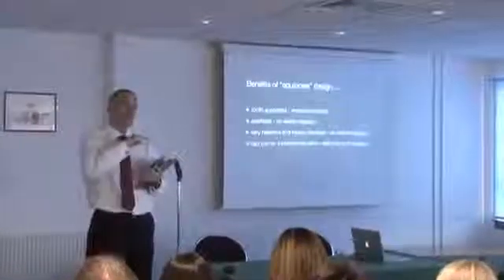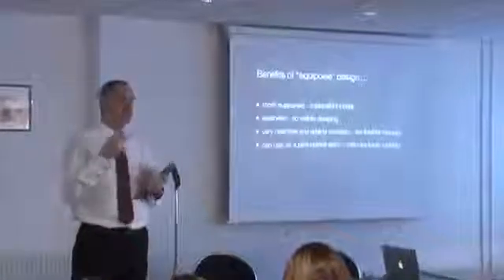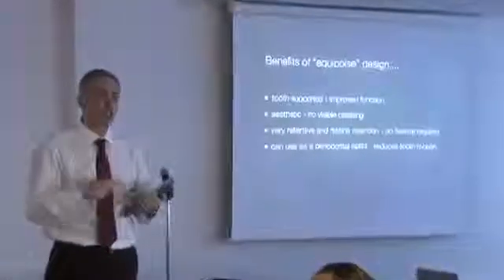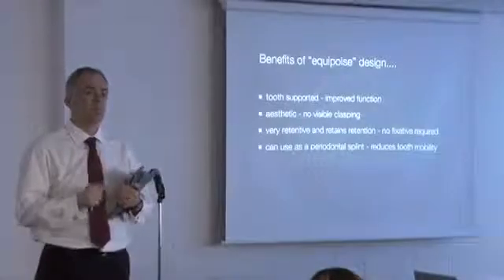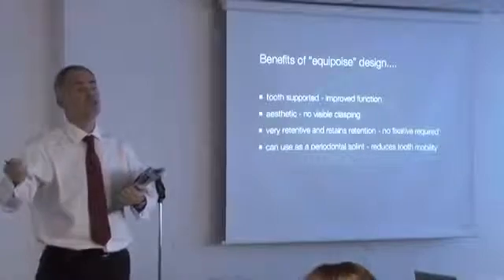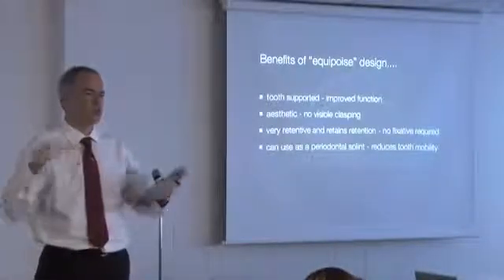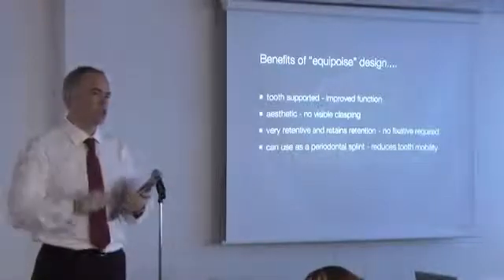This is something that I think we all avoid. We have periodontally involved patients. We would like to splint those teeth together, but we don't want to invest in the cost of doing both when we know we're going to have to do it again in a year when they lose another tooth. We can use this as a periodontal splint, and we can design it in such a way that if they lose teeth in the future, we can continue to add to it. Because we know which teeth are going to be there for the long haul. And we can use the other ones knowing that they're going to be expendable in the future.